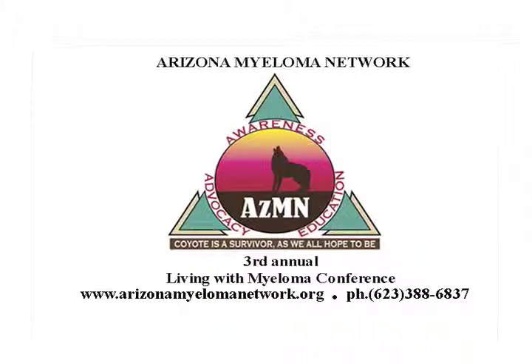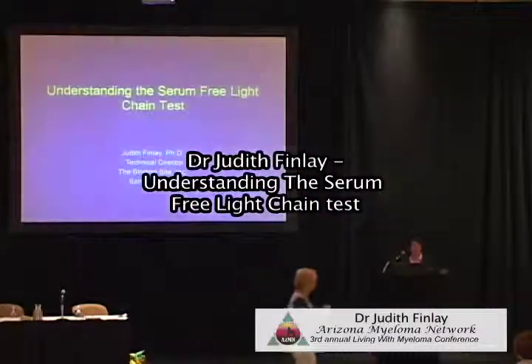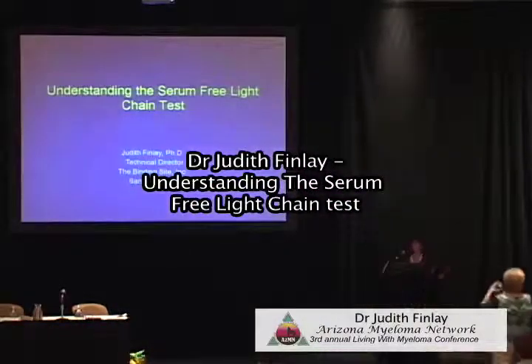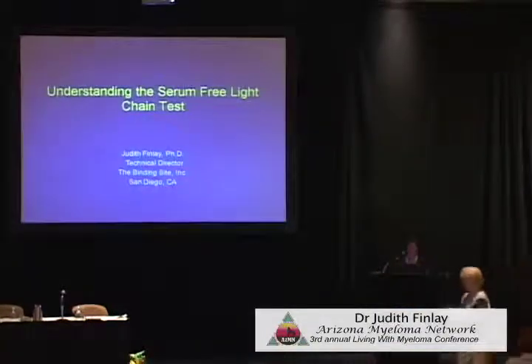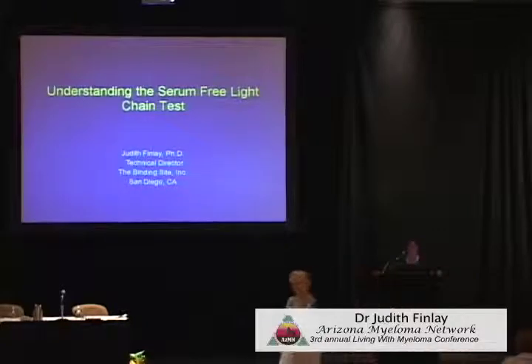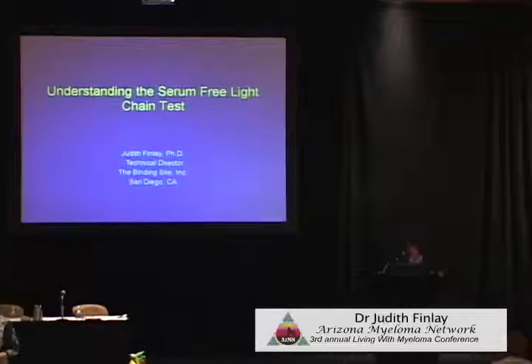I'm going to talk to you this morning about understanding the serum free light chain test. A lot of you in the audience probably have had the test, and maybe some of you haven't had the test. This will give you some good information about the test. The serum free light chain test was introduced in 2001, and it's changed how monoclonal gammopathies, multiple myeloma, and AL amyloidosis are assessed.